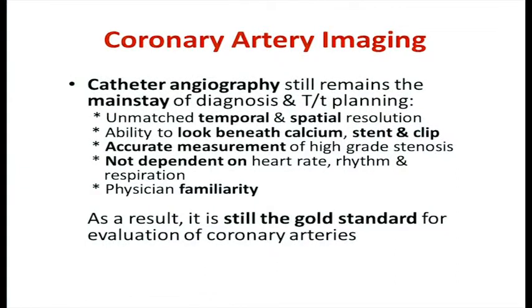It's on my last slide. So I would like to end by saying catheter angiography still remains the mainstay of the diagnosis and the planning because of its very high spatial and temporal resolution. Though the CTs are becoming more and more advanced with higher temporal and spatial resolution, at the moment the catheter angiography is unmatched for its temporal and spatial resolution. Also, it is not affected by the motion artifacts because of cardiac motion and breathing, and it has the ability to look beneath the calcium, stent and the clips.